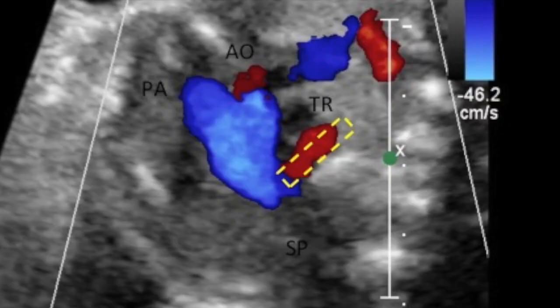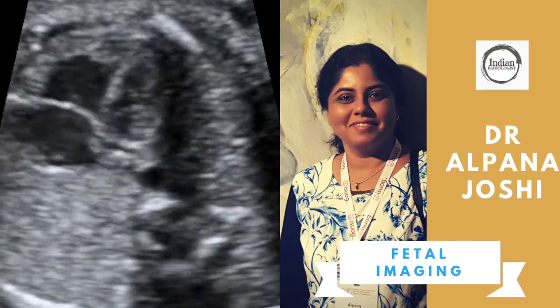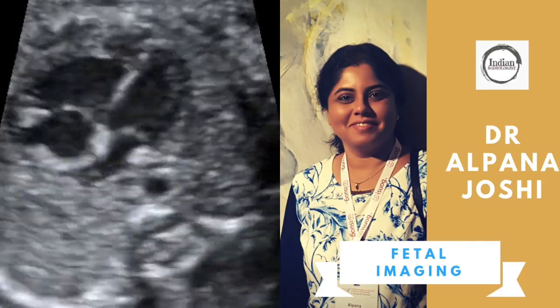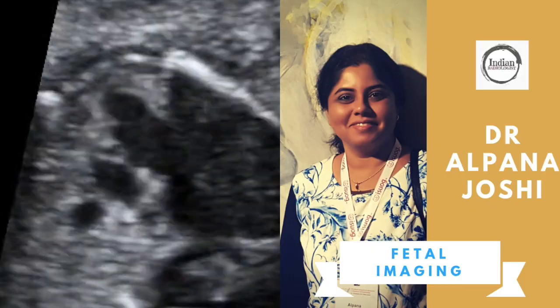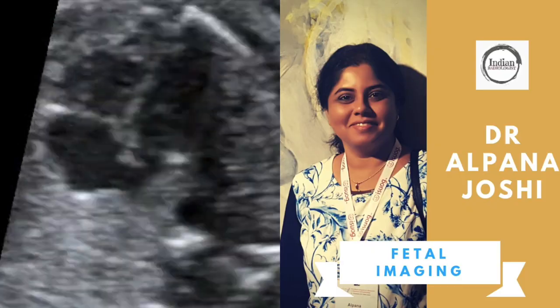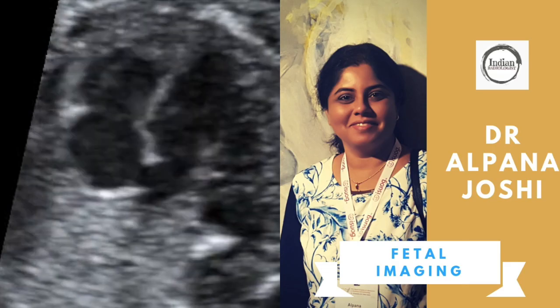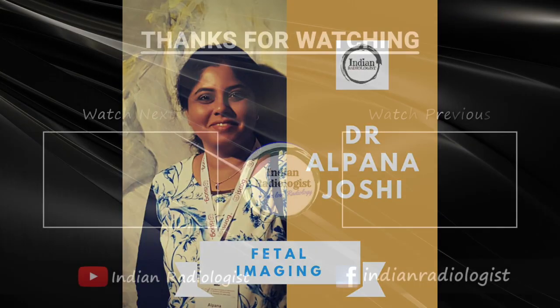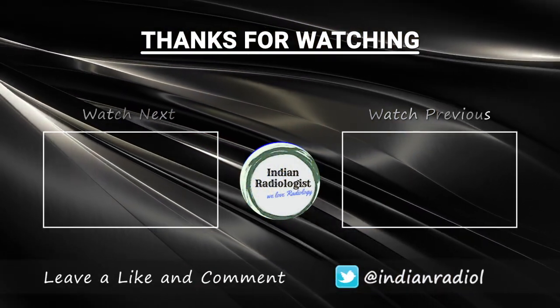The aberrant right subclavian artery: you can see the pulmonary artery, aorta, and ductus arteriosus to the left of the spine, but there is a vessel going behind the trachea — that is the aberrant right subclavian artery. This concludes our series of videos about fetal heart assessment during anomaly scan. The four chamber and three vessel trachea views are easy to obtain, and outflow tract views can be learned with practice.